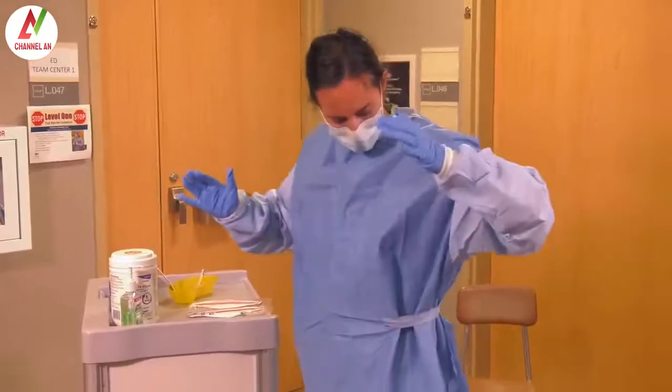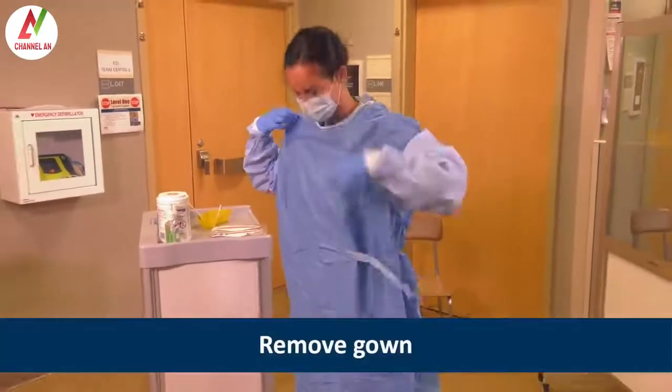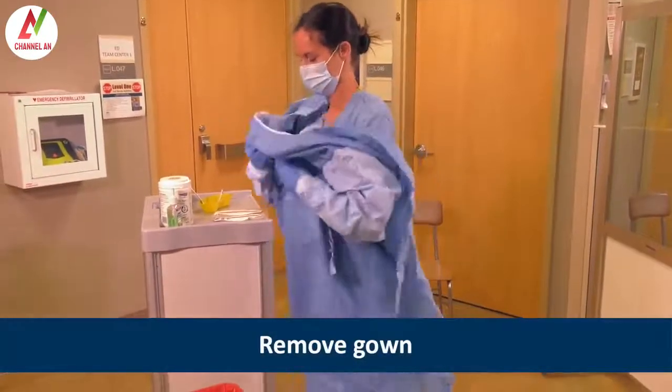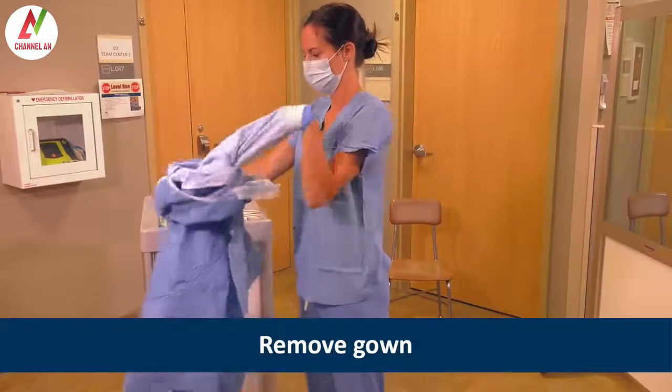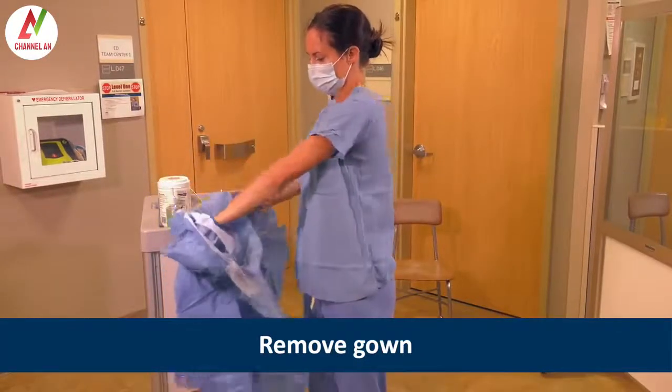Heather removes the gown by untying or gently breaking the fasteners. She carefully pulls the gown away from her body, folds it inside out, and places it in the waste receptacle.